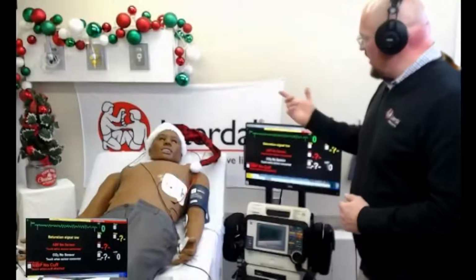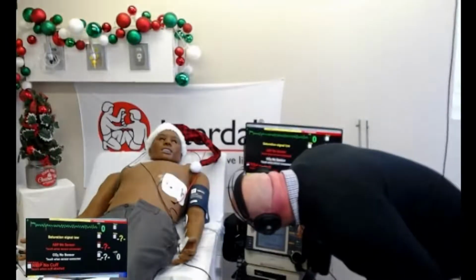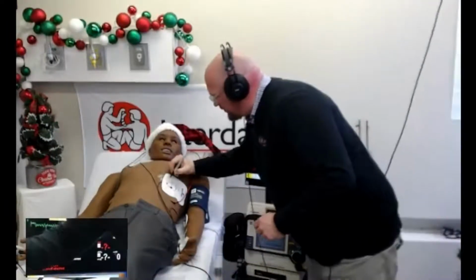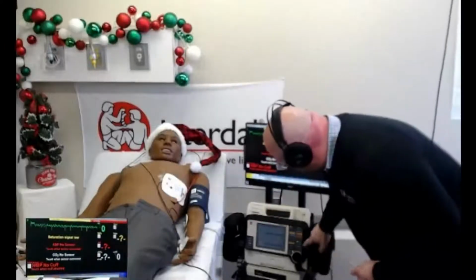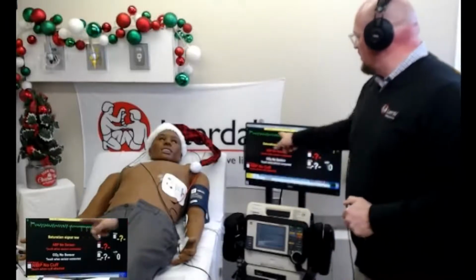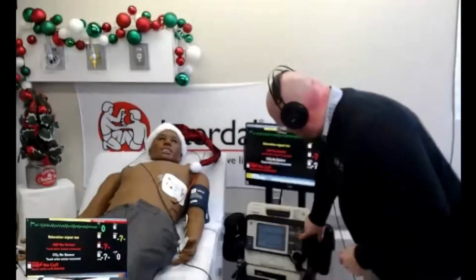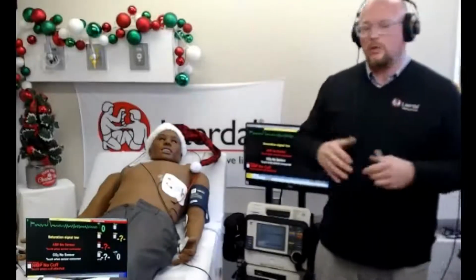All right, so now we have VFib. I'm going to go ahead and go 200 joules. So again, I'm going to try to remember what I did. I shocked him twice, and now I'm going to hit him with 200 joules. And here we go. So there's my VFib, 200 joules. I'm clear, everything's good. Yeah, there we go. Shock, no arc, there is no smoke.